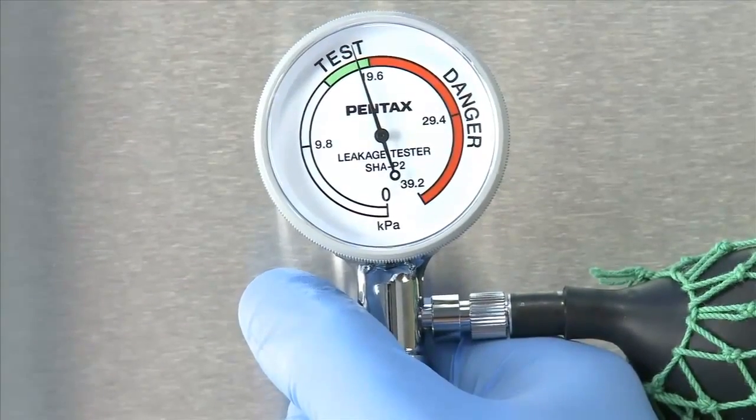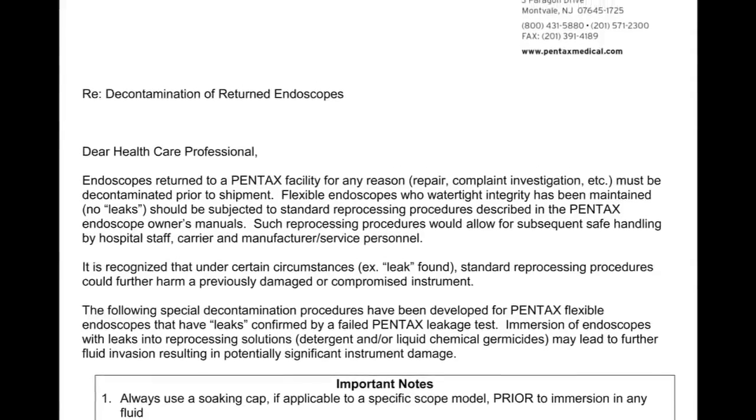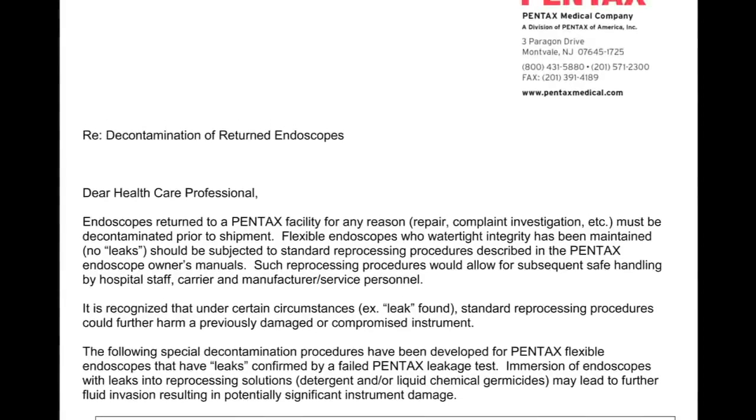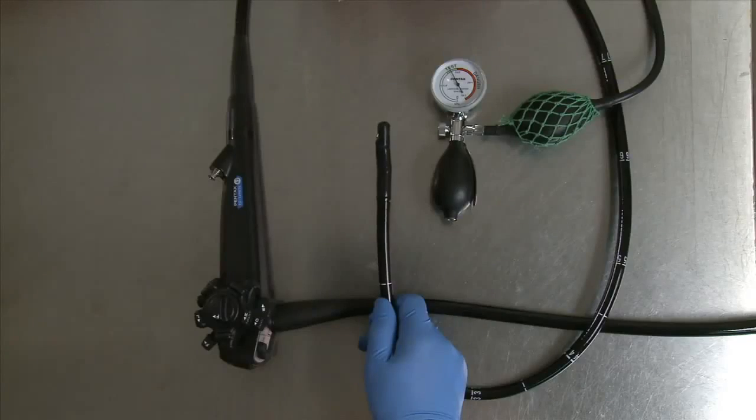If the indicator needle drops rapidly, a leak may be present. Stop and refer to the PENTAX decontamination procedures. Do not proceed with the wet leak test, cleaning, or disinfection until you know that it is safe to do so.